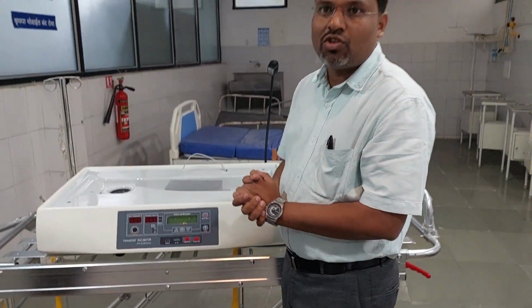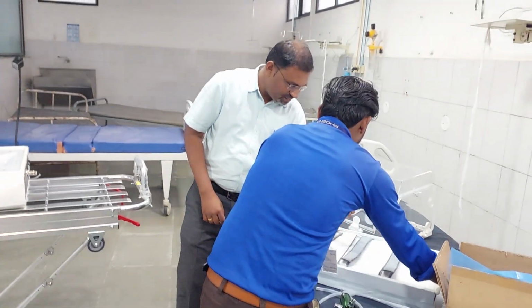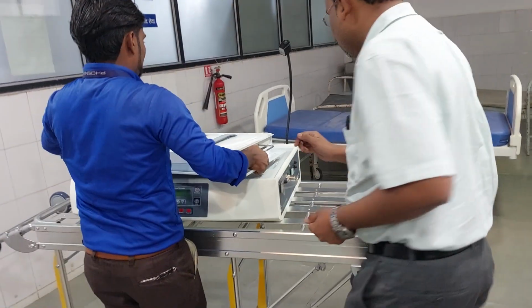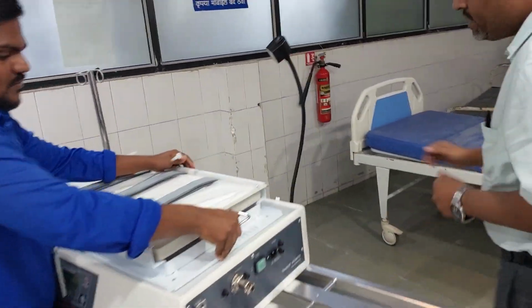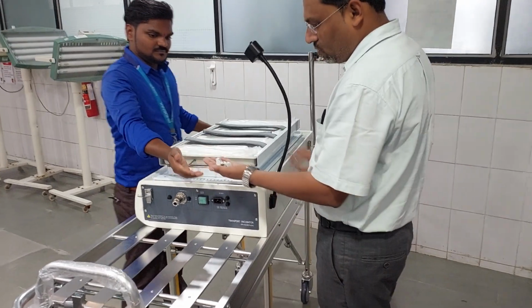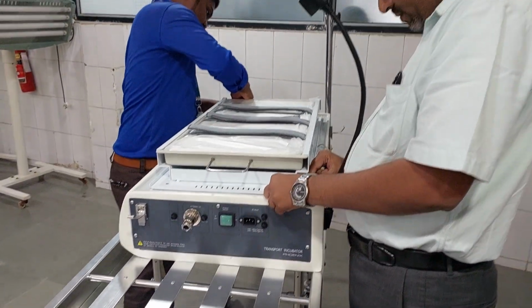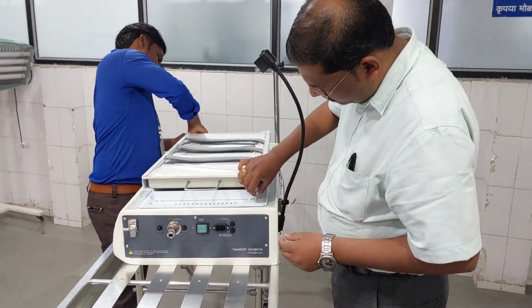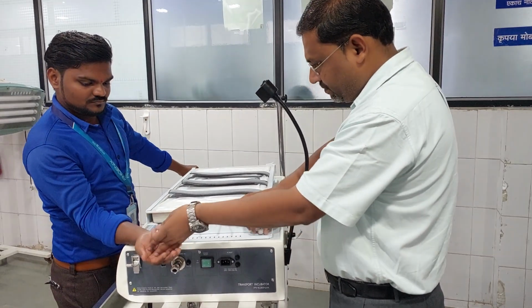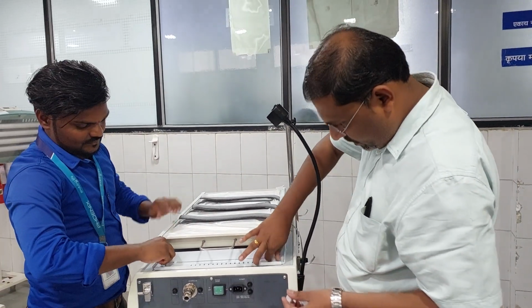Now we'll start the installation procedure. At the start we have to fix this base plate. Come close. See, while fixing the base plate you have to take care of this air temperature probe. These four screws they have provided, just try to match these screws, fix it properly. Right, tighten it.